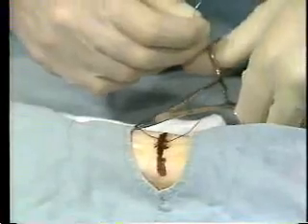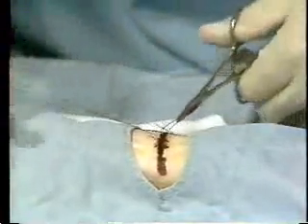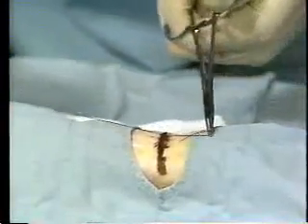Wrap the long end of the suture twice around the needle holder in a counterclockwise direction. Pull the short end through the loops and pull ends to tighten the knot and complete the second knot.